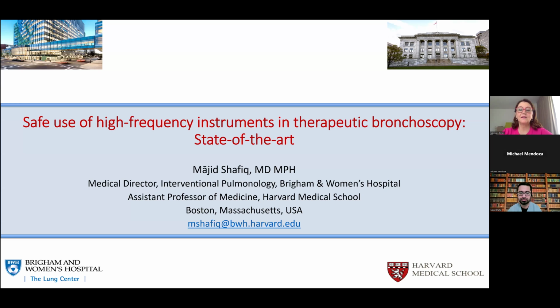Thank you. Another question from the audience. Does increasing our APC duration also increase the depth and lead to perforation of the airway? That's a great question. So, the package insert says that the APC's depth of penetration is very constant, very consistent. My feeling is it's probably true.